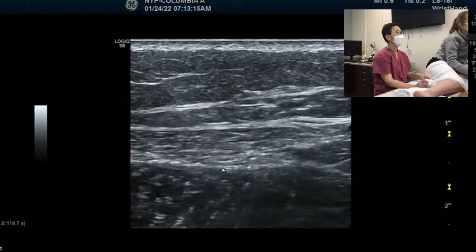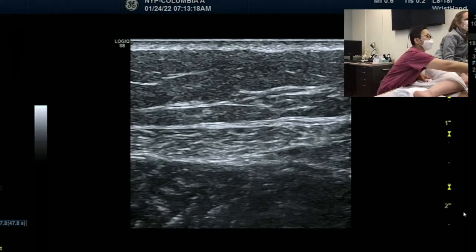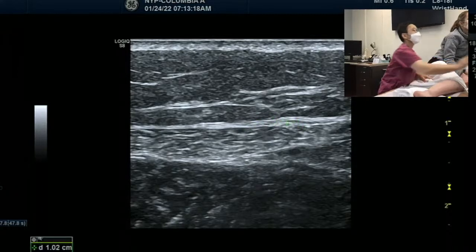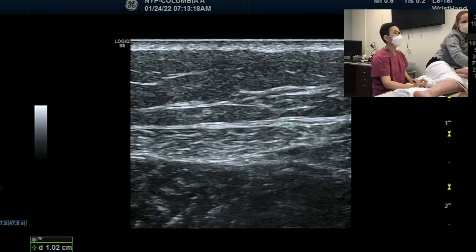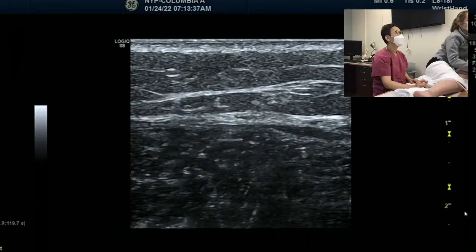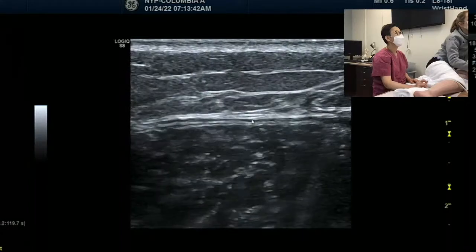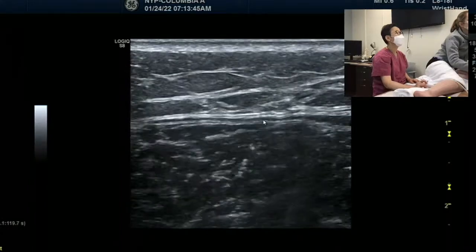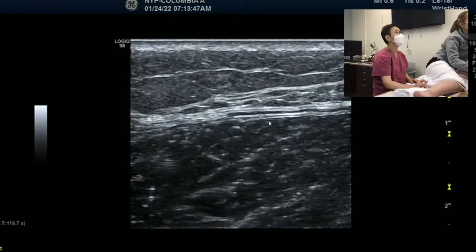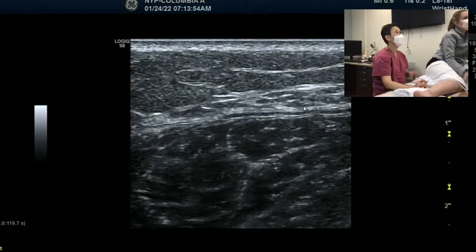Can you freeze here? I was telling a lie, but I saw splitting. This is one, and this is the second one. They are splitting here. So if you unfreeze, you see the dark area? Now you know exactly where we're talking about. If I go down that area, follow, look at that area. Now you can see the sural nerve over there. Above. That one. Now you know.